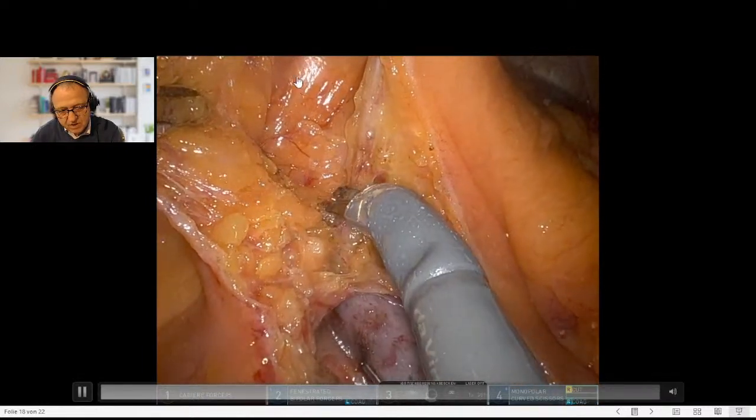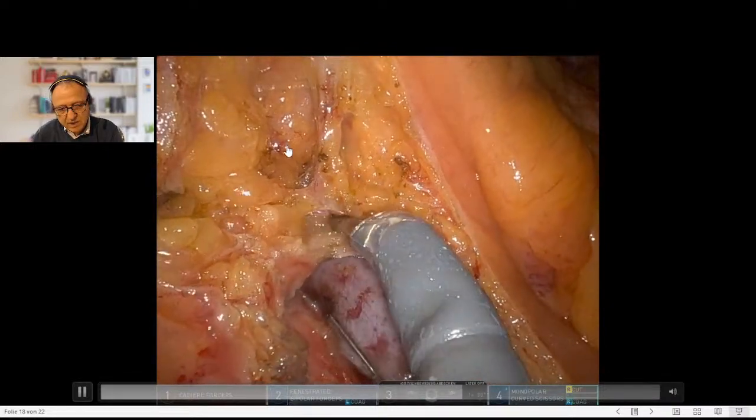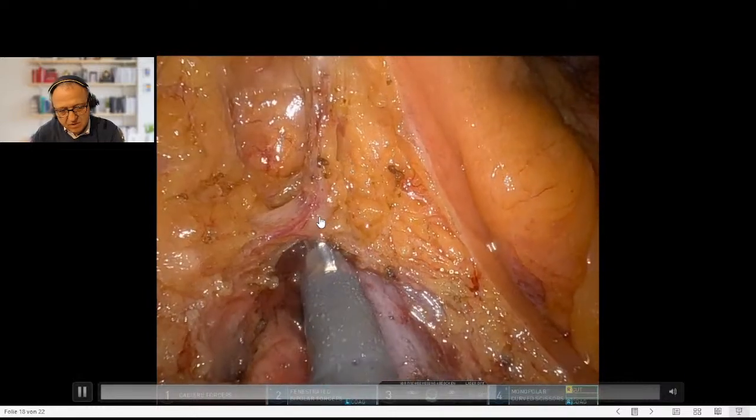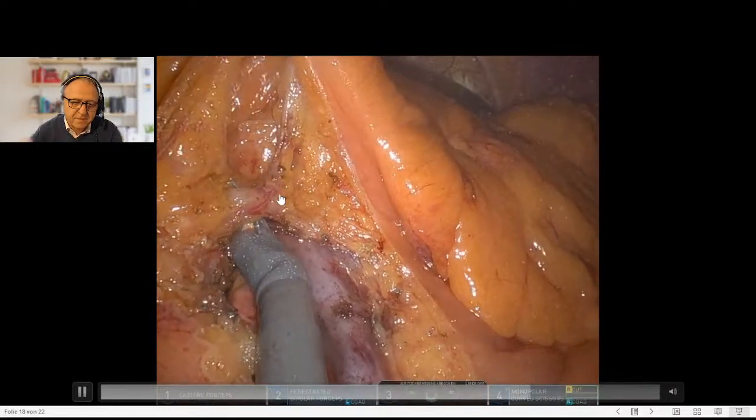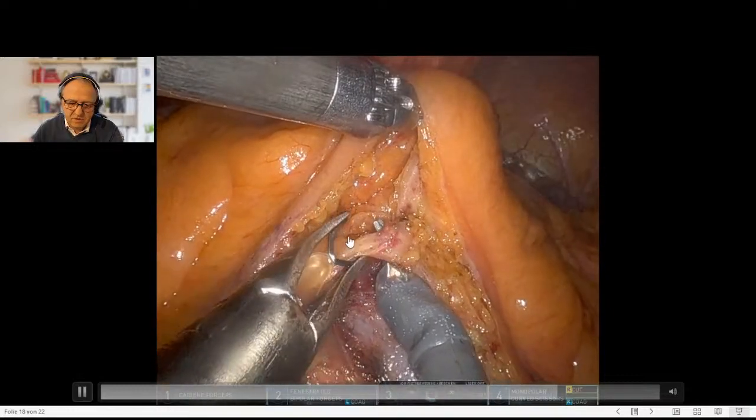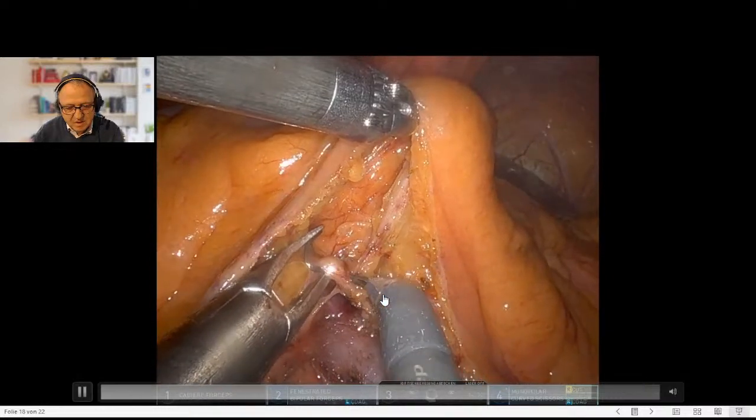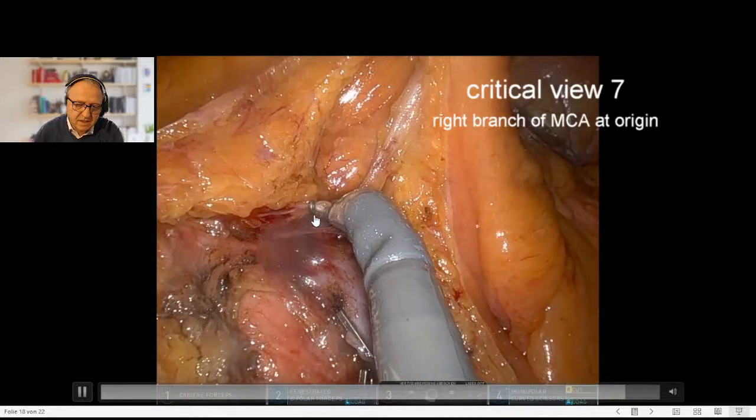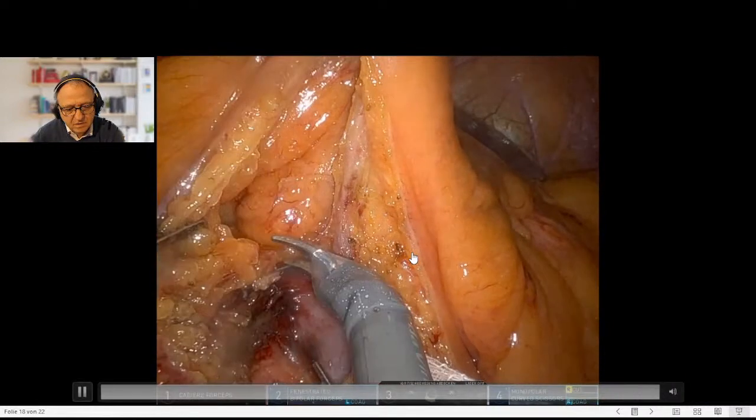We reach the former lesser sac here and dissect our way down to the right branch, which is usually a vessel that runs off at 90 degrees right at the base of the mesocolon. We're safe here because the lesser sac is open and we know we're not running into the pancreas. The vessel is then clipped and dissected. This can also be done with hemolocs, but I don't like the bulkiness.